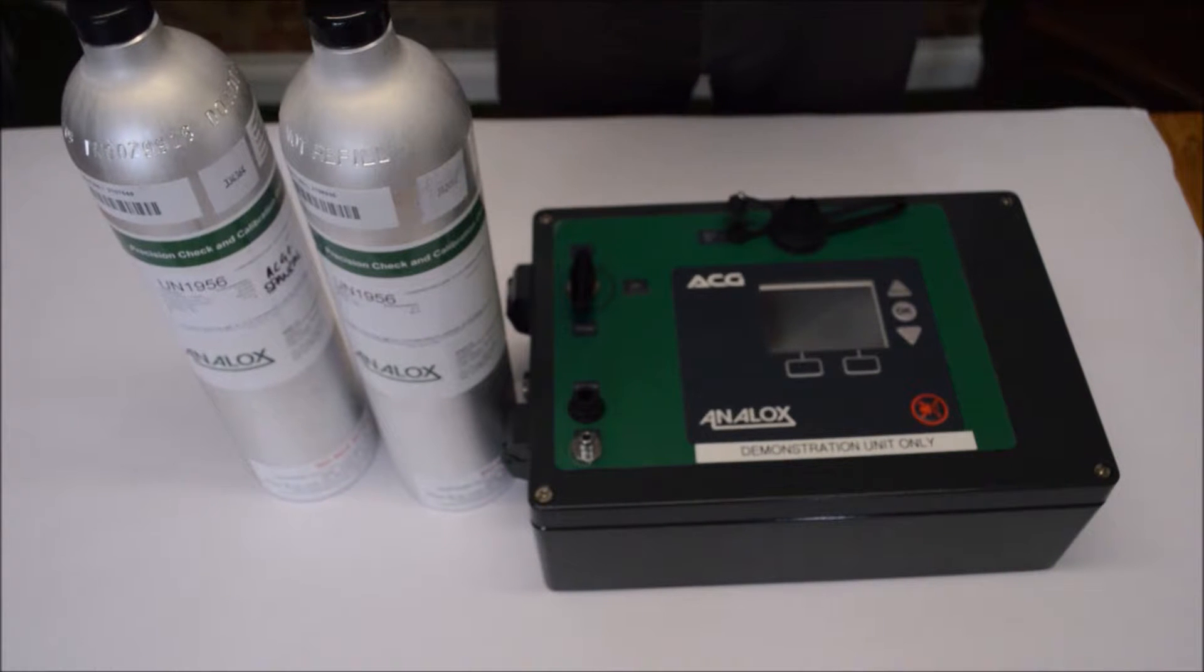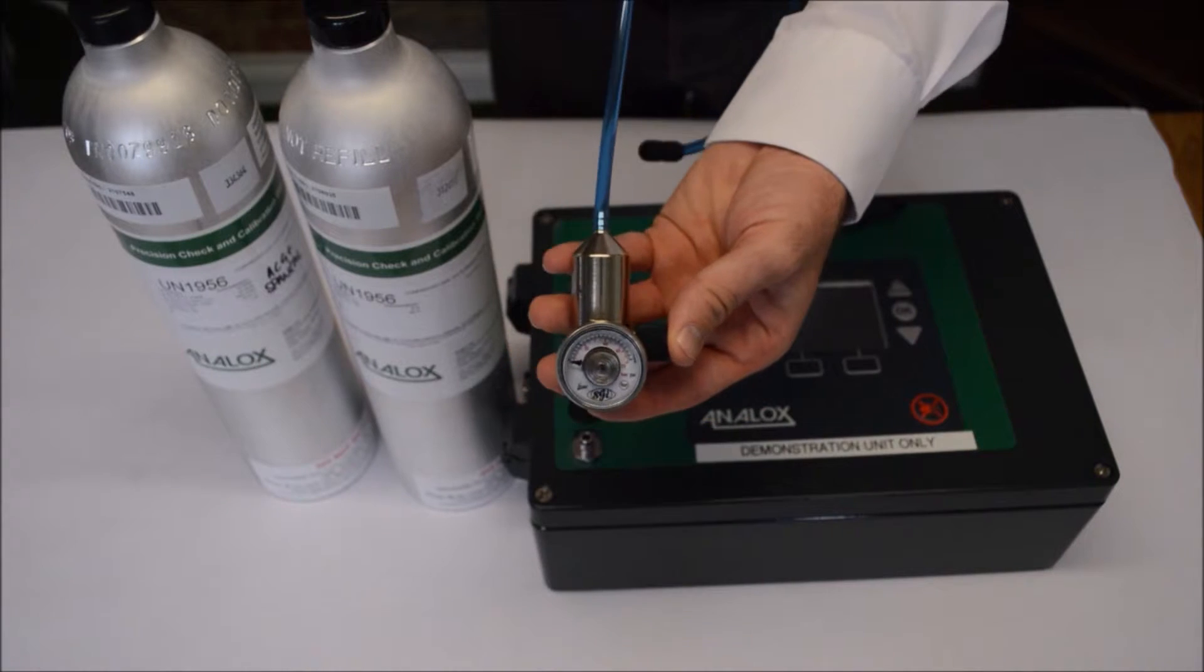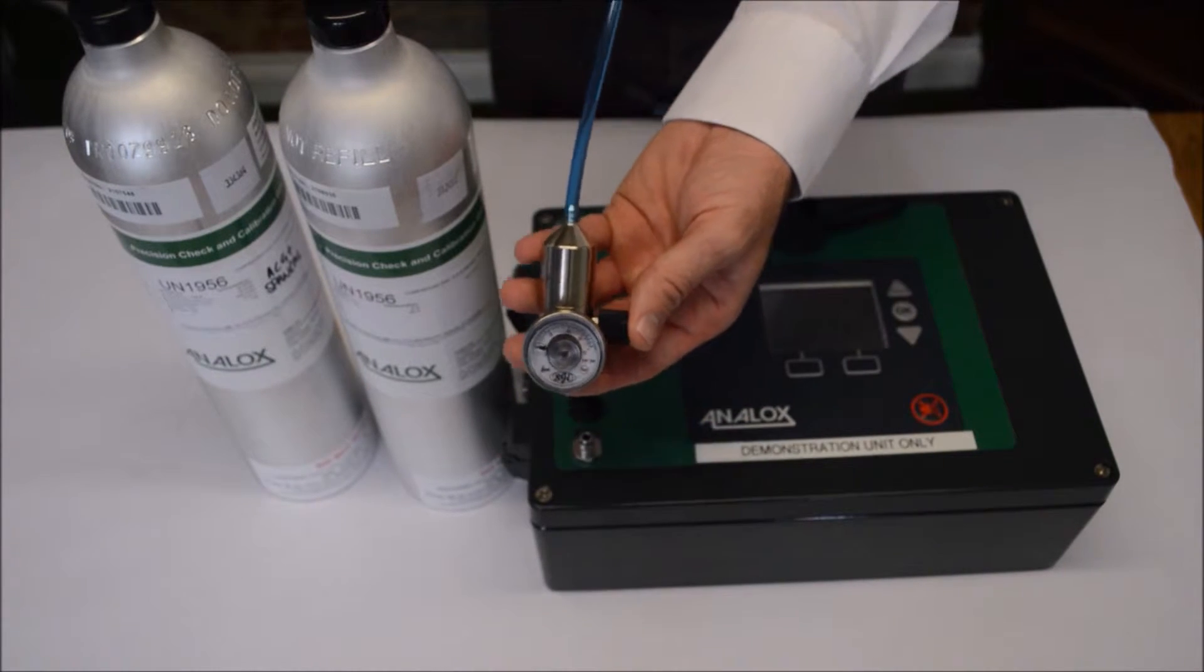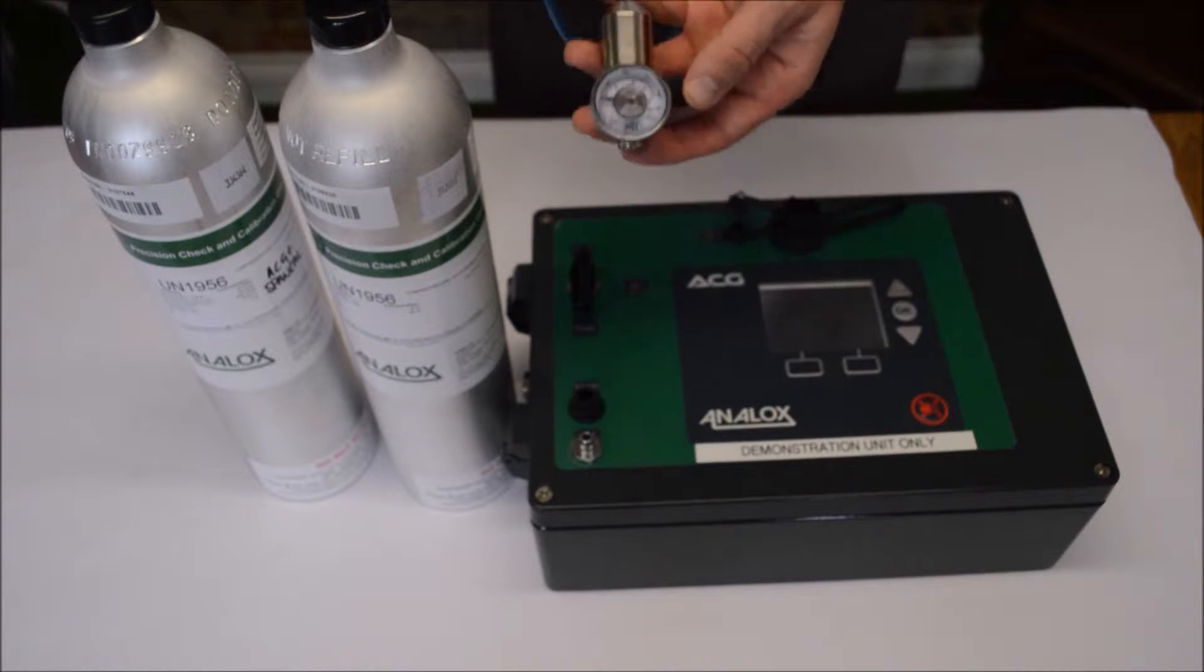We can adjust the gas mixes you need if you can't get these exact concentrations. What you also need is a calibration gas regulator. This reduces the flow from the calibration gas into the ACG unit to half a litre per minute.